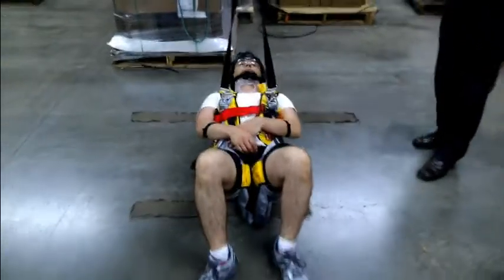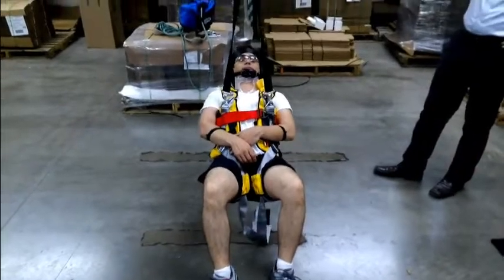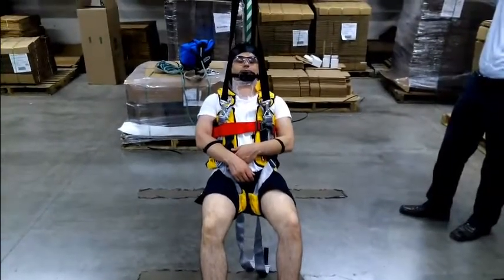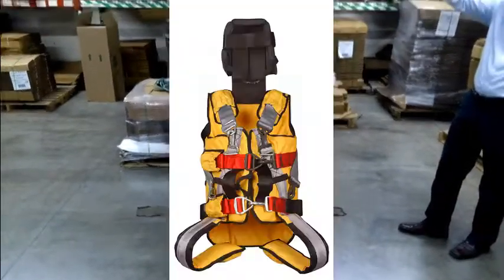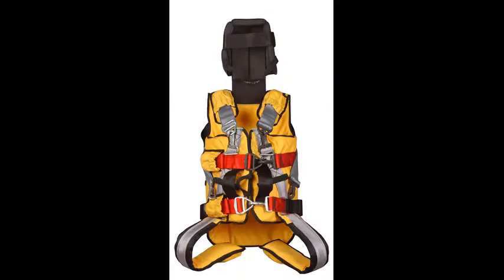As the patient is lifted, he maintains a vertical body position because the legs balance out the rest of the body, and he can be safely lifted from his location. This has been an overview and demonstration of the L720 vertical extrication device.